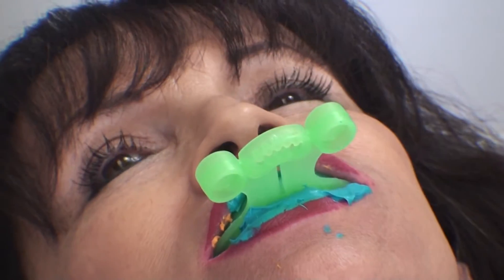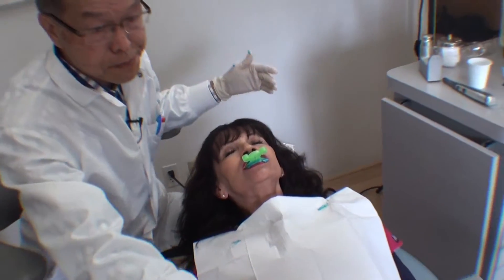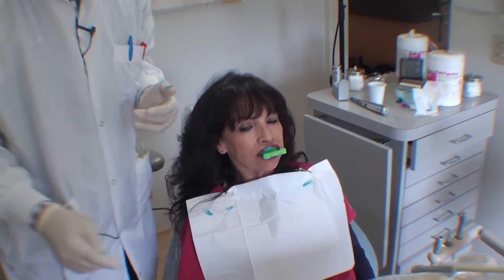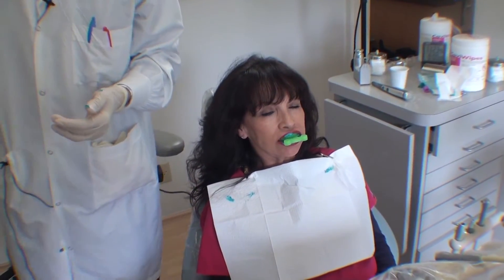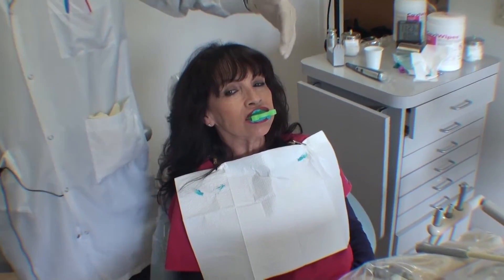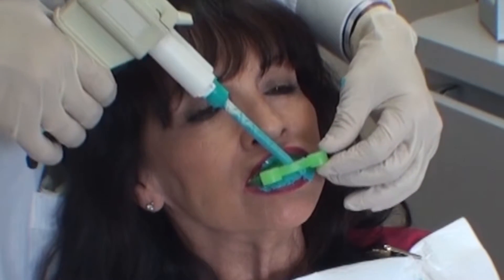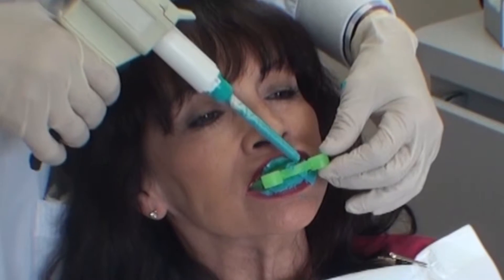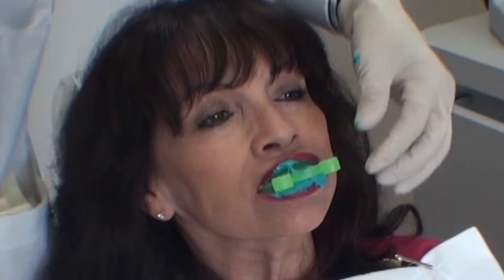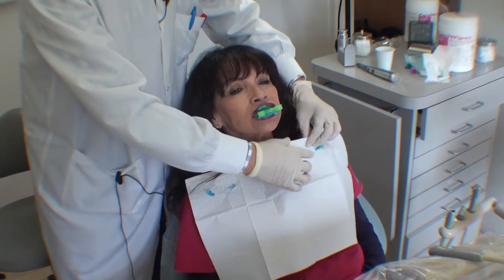Once that's done, you probably want to seat the patient upright. Then you can use either the heavy body material or a bite registration material and squirt it into the hole in front of the tray. Wipe it so that it's flat and wipe out the excess.